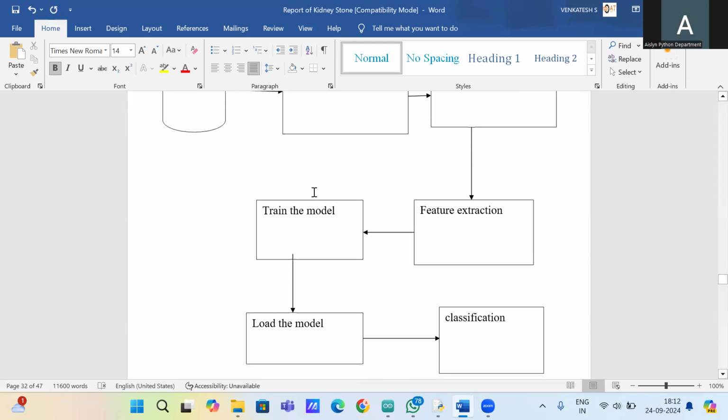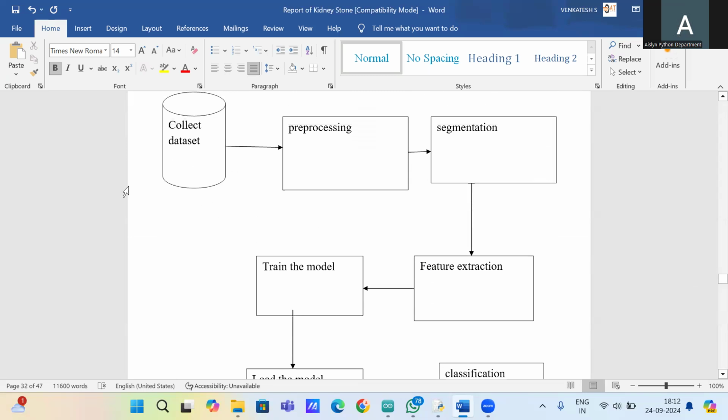Yeah, this is a workflow. First of all, we collect the dataset from Kaggle. We pre-process, in the sense that we put all the images to one size before giving them to the model. Before that, we will do segmentation, and in feature extraction we extract features from the image by using CNN layers. That would be the main layer.